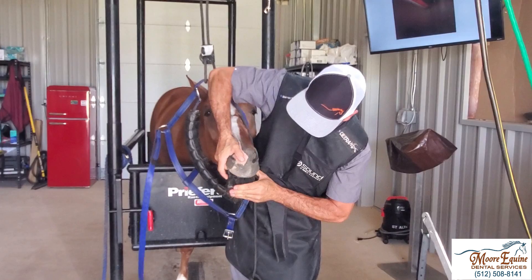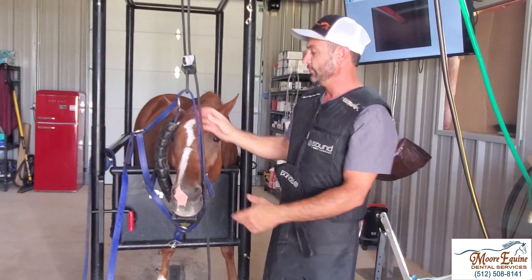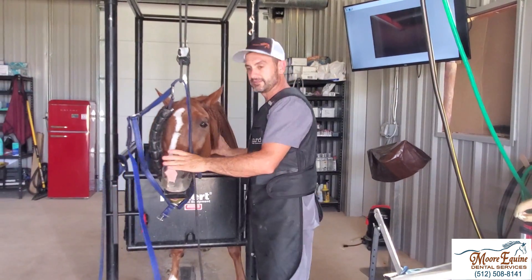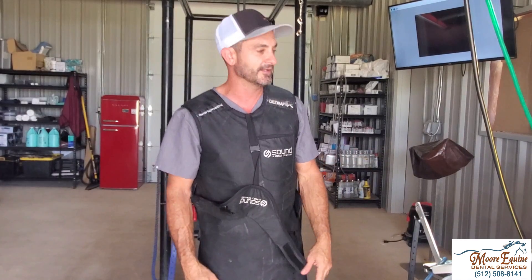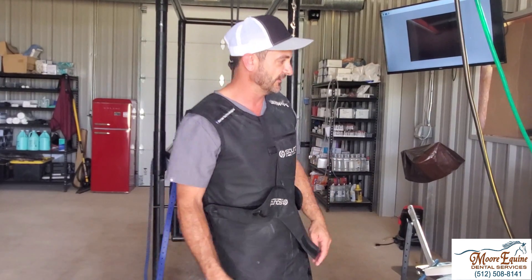He's biting down pretty hard, so we put the block here. One misconception that a lot of gurus will tell you is that you need huge crews to do all these dental procedures. Here we've got a horse that needs an extraction and I'm going to do it by myself — you don't need anybody. In this case we have to have somebody film the video, but you really don't need a huge crew if you have the right training and equipment.